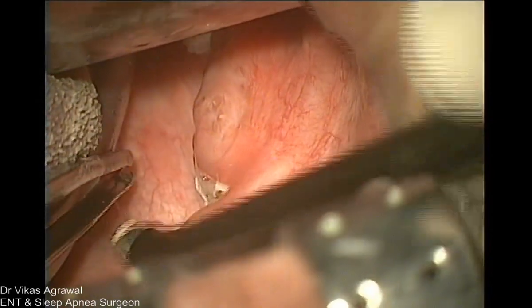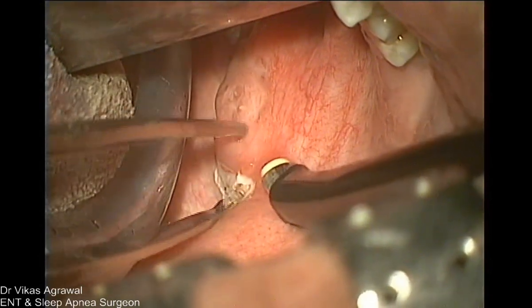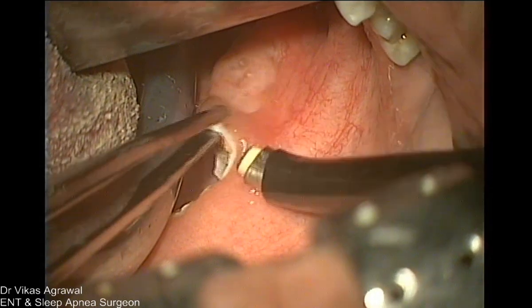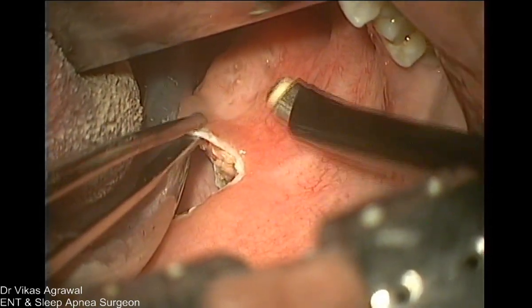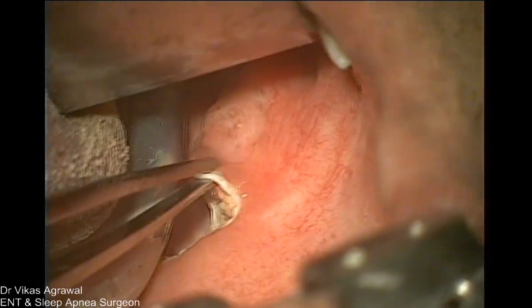Now see, we have done the left side. Now see how much is the difference already created. And we saw that in our sleep endoscopy, this was the area causing the maximum problem. So now we are going to the right side. This is the right tonsil. Is the picture good? Yeah. Is it centralized? Yeah, very well seen.